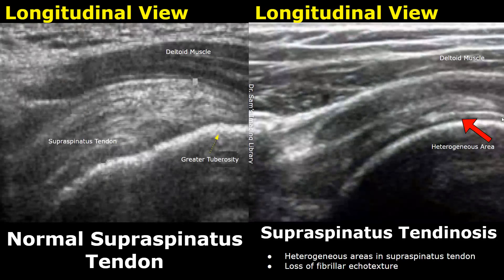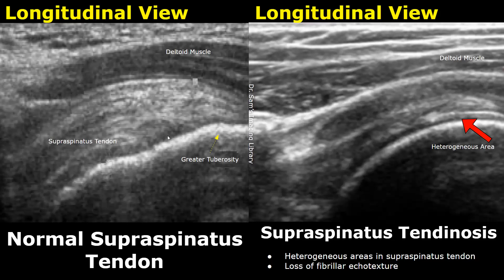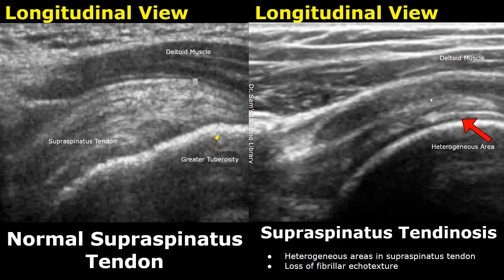Here is a longitudinal view of the supraspinatus tendon. We can see the normal fibrillar structure, which are alternating hyperechoic and hypoechoic lines, often found in tendons and muscles. In the case of tendinosis, we will find heterogeneous areas and loss of normal fibrillar echotexture.